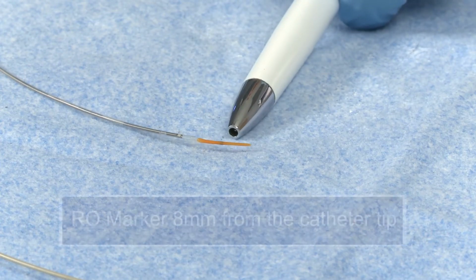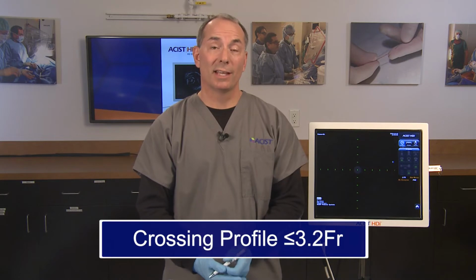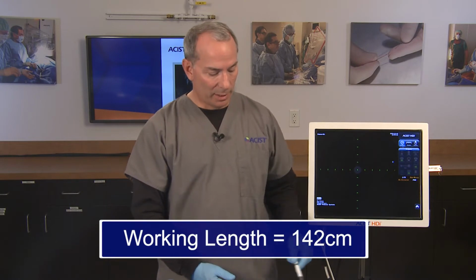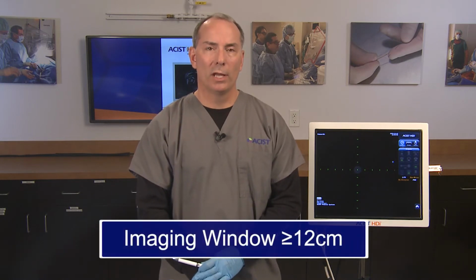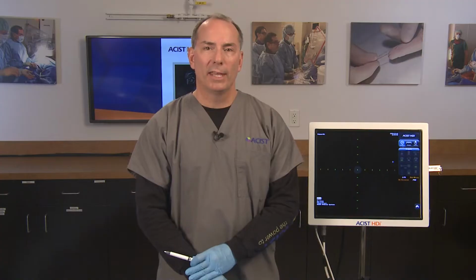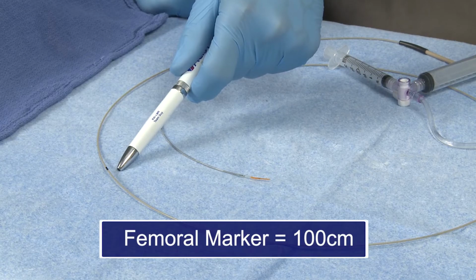The monorail has a distal radiopaque marker that is located approximately 8 millimeters from the distal end of the catheter. The catheter's distal tip entry profile is less than or equal to 2 French. The crossing profile is less than or equal to 3.2 French, and the working length is approximately 142 centimeters. The catheter has a greater than or equal to 12 centimeter long imaging window and associated telescope assembly. The catheter's femoral marker is located approximately 100 centimeters from the distal tip of the catheter.